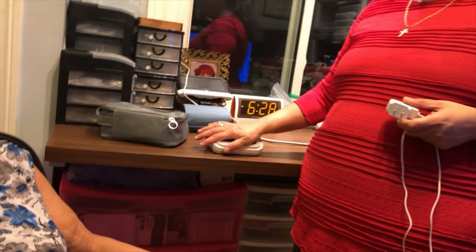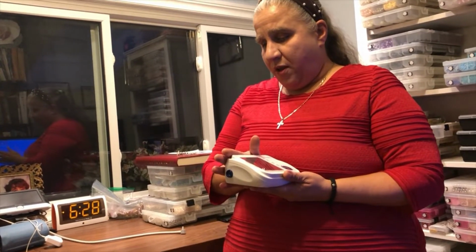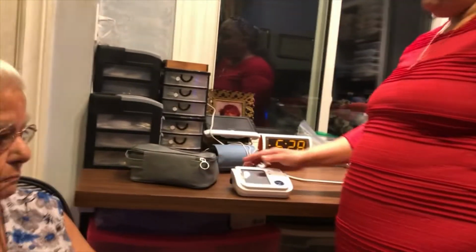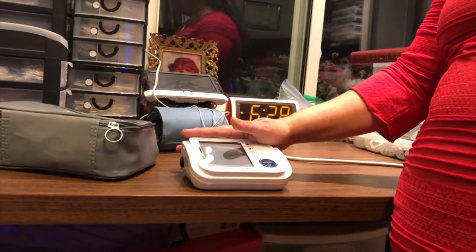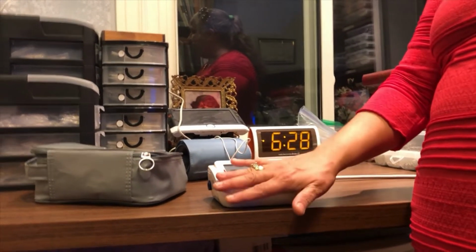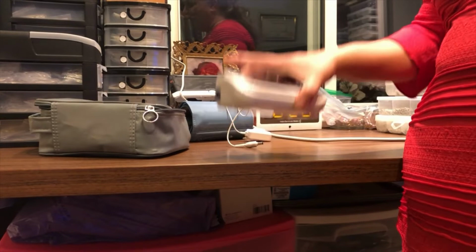It's got a huge LED display at the front. It's not really a square, it's not really a rectangle, it's kind of a rectangle on a slant. As you put it down on your counter, the top part is slanting upwards. So if you run your hand down the device, you go down as if it's a slide. So it's a rectangle thing on a slant. I know that doesn't make sense, but that's okay.